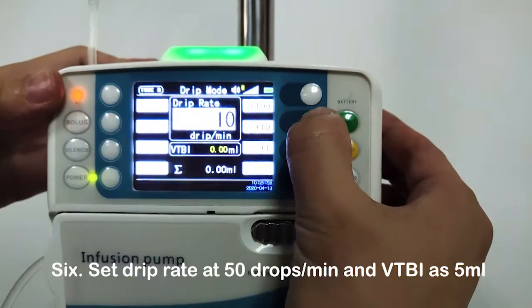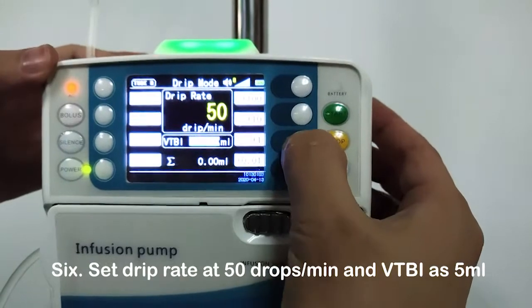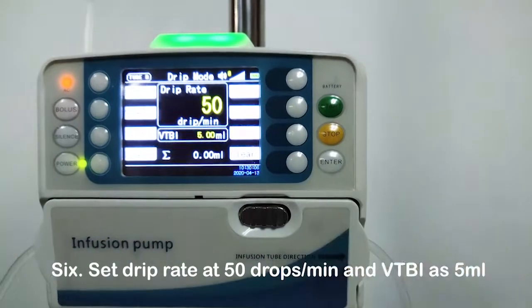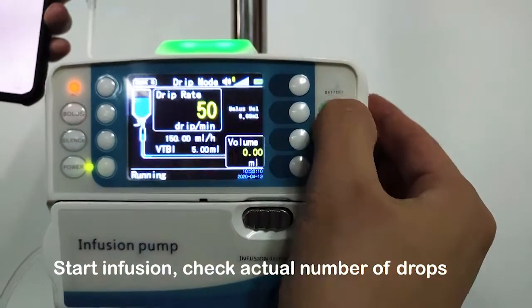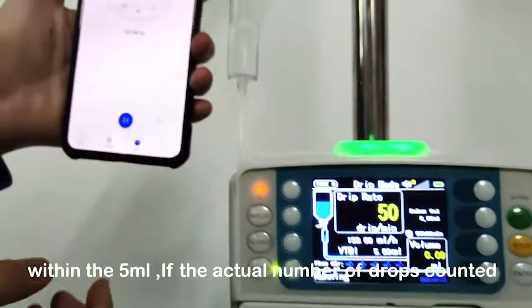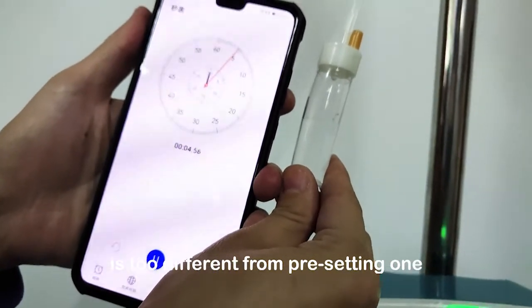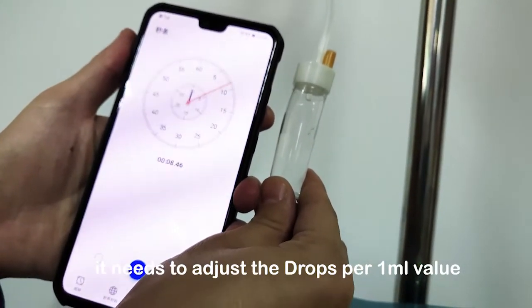Set the drip rate at 50 drops per minute with VTBI at 5 milliliters and start infusion. Check the actual number of drops within the 5 milliliters. If the actual number of drops counted is too different from the preset value, it needs to be adjusted by changing the drops per 1 milliliter value.